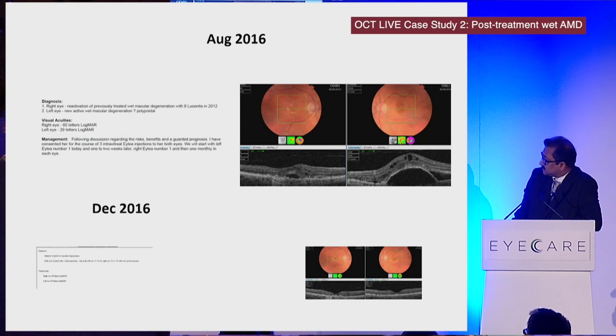And this is her in December 2016. You could see the retina is quite settled in both eyes with good vision. So as per protocol, she's listed for another 4 injections every 2 months in each eye. Unfortunately, we couldn't give an injection in the right eye just now because her INR was high; if it is more than 3, we don't do injections. But she's under regular follow-up for more injections. So this was in December last year, and now we have the live images for this patient.